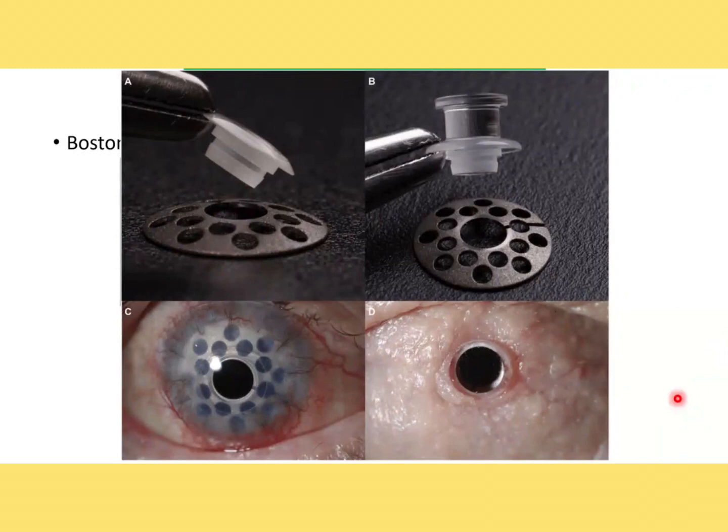Here, the procedure of surgery, I would explain to you, is that during surgery the damaged cornea is removed and the Type 1 K-Pro is implanted and stitched onto the eye. The front plate provides a clear optical surface for the light to enter the eye, while the back plate ensures stability and integration of the surrounding tissue.